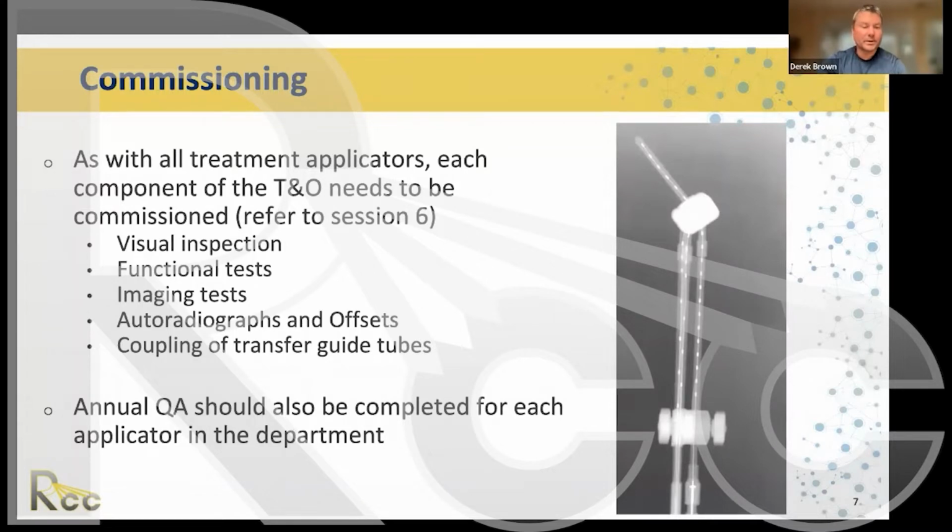Just as a bit of a side story, we recently had a case with a tandem where at the end was a little connecting piece that was supposed to be always connected, like it was glued on there, and should never have come off. But over the course of time and sterilization, that piece had started to slip a little bit.